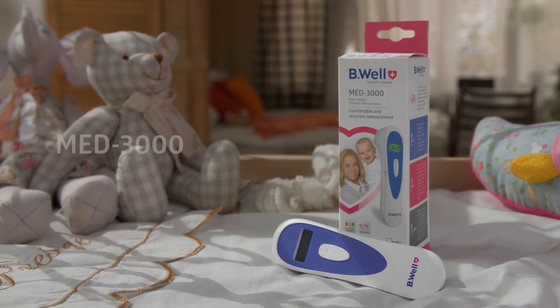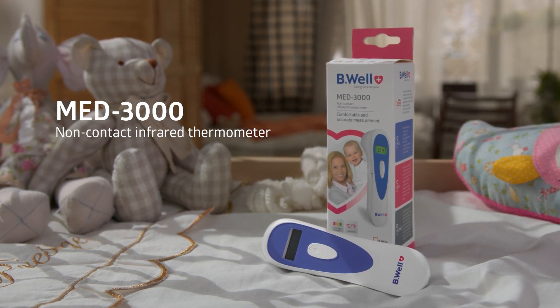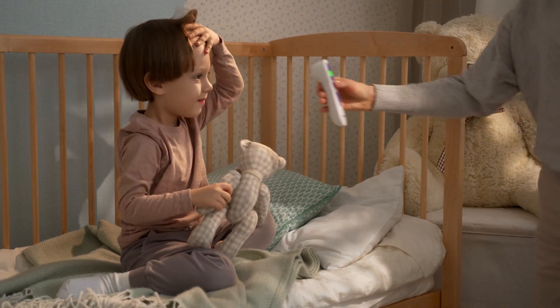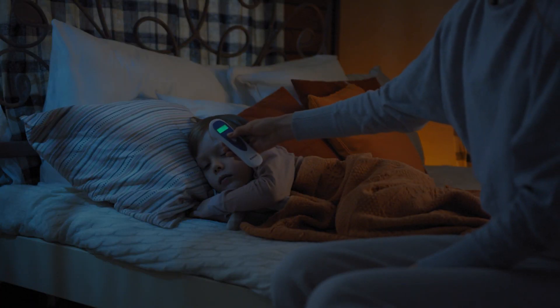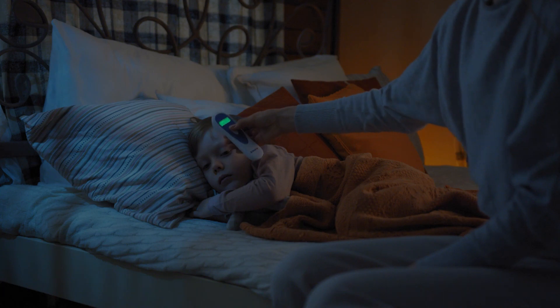Be Well — caring for everyone. Non-contact infrared thermometer Be Well Med 3000 with color display backlight. Be Well specialists in Switzerland have developed a non-contact infrared thermometer for instant temperature measurement. It's convenient for mom and will not disturb a sleeping baby. Be Well helps you take care of your loved ones' health.